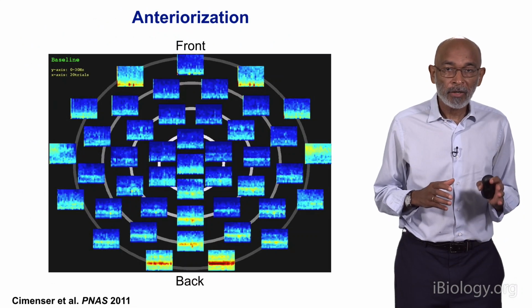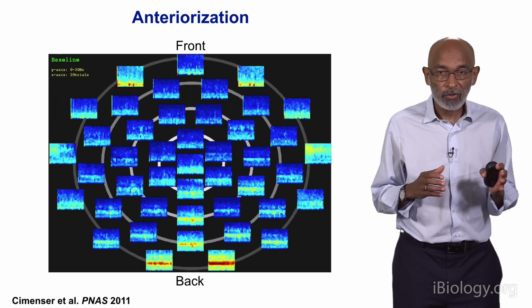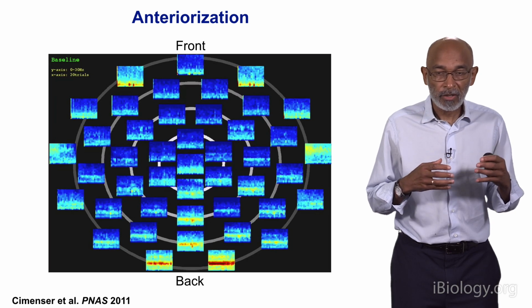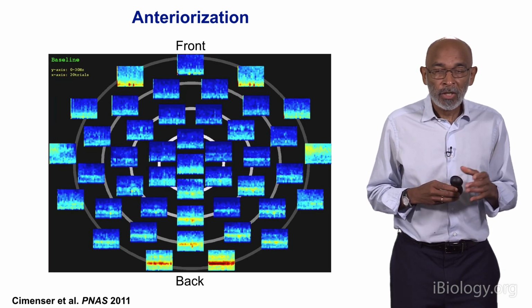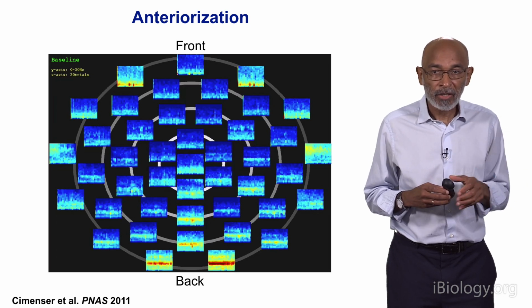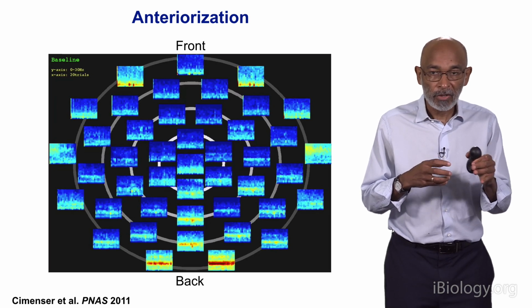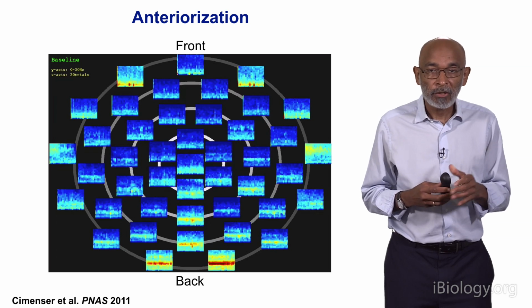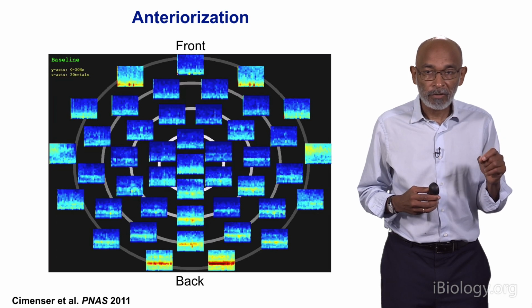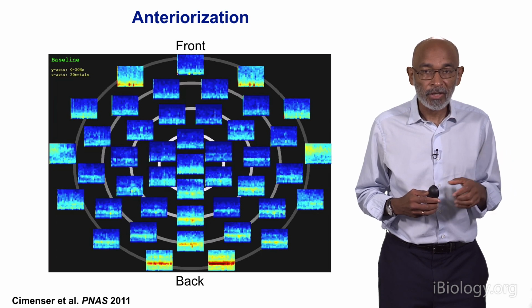So I've told you a little bit about the structure and the EEG rhythms that you see in time with propofol. Now I want to tell you about what they look like in space, where space is across the head. So if you place EEG electrodes across the entire head, you can record the different patterns that the drug produces at different locations across the scalp. So to make this clear what I'm going to be describing, I need to give you a little bit of history from anesthesia and also a little bit of history from neuroscience.